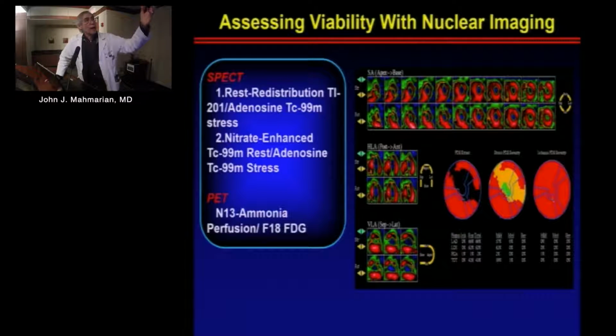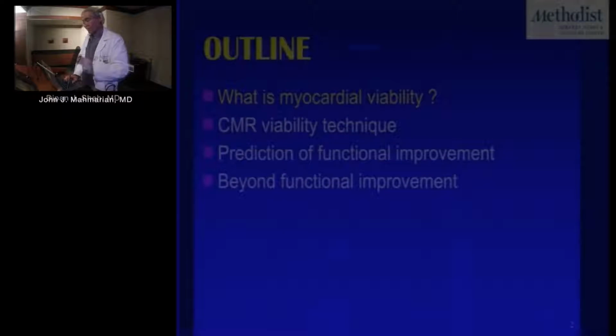We also do nitrate-enhanced technetium studies followed by adenosine stress. Again, the same kind of issue. So for SPECT imaging, that's our standard protocols, and then for PET, obviously FDG still remains the gold standard in terms of assessing viability with that technique. Thank you.